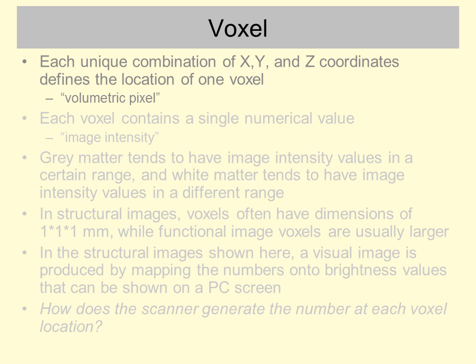Voxel stands for volumetric pixel, and the brain in your image is made up of a lot of these small square pixels stacked together to produce one cubic image, because when we begin, at least, we've got parts of our image that correspond to air outside the head. So we've got a cubic image when we first take our images off the scanner.